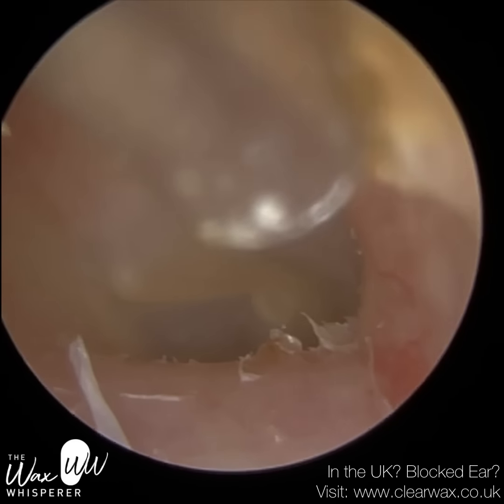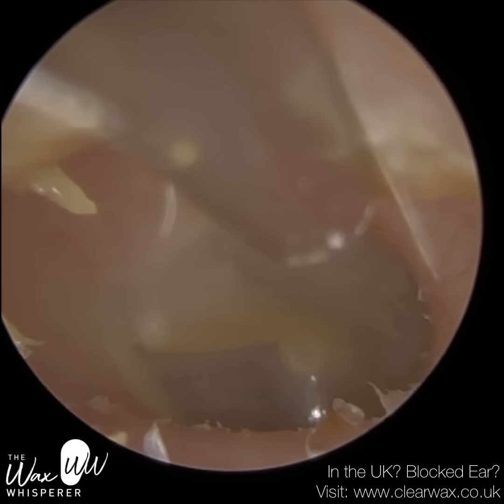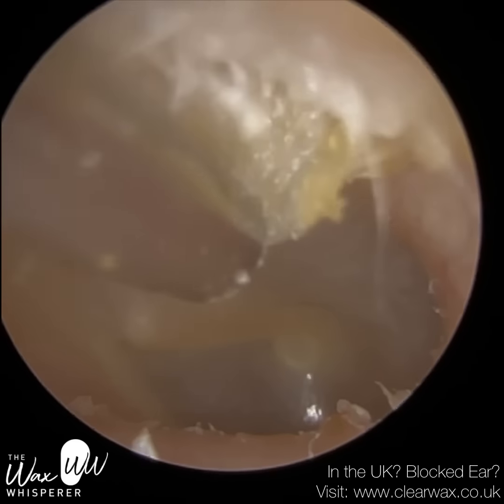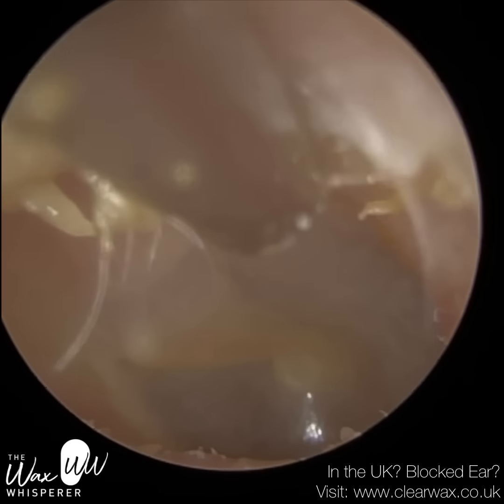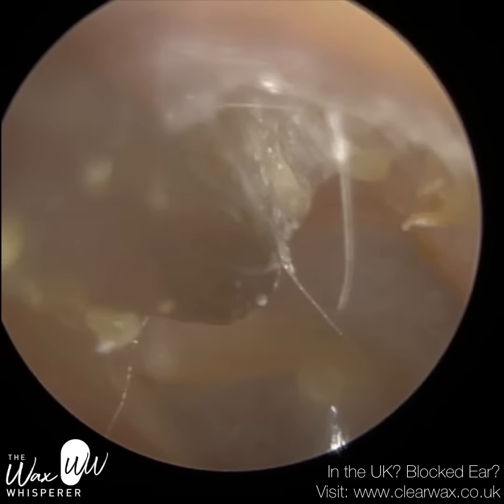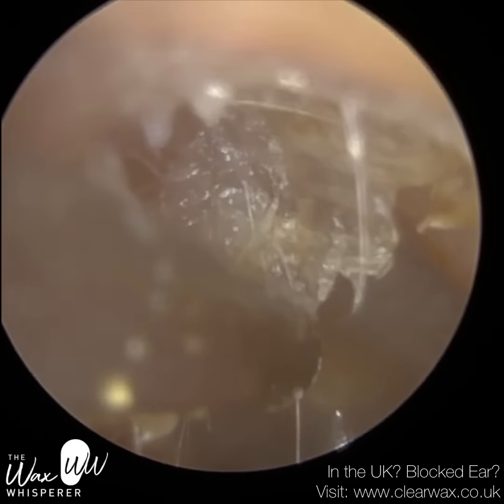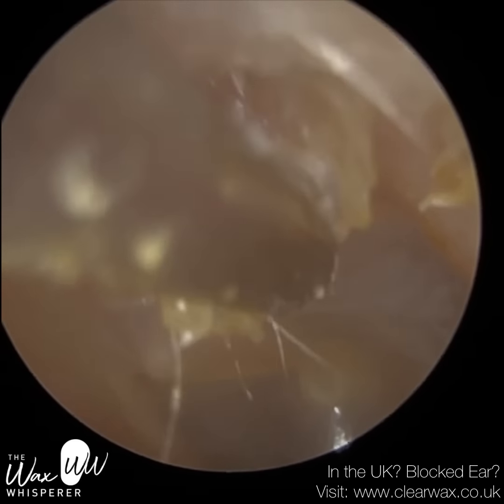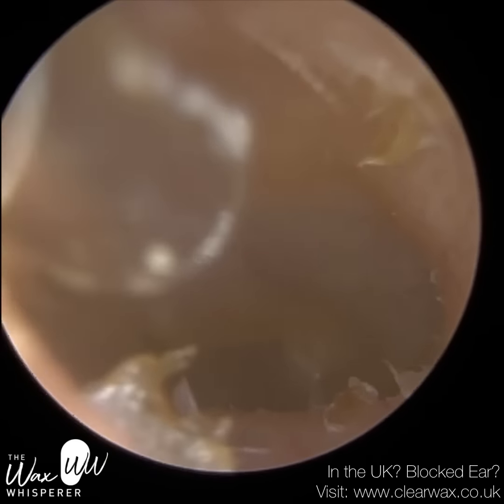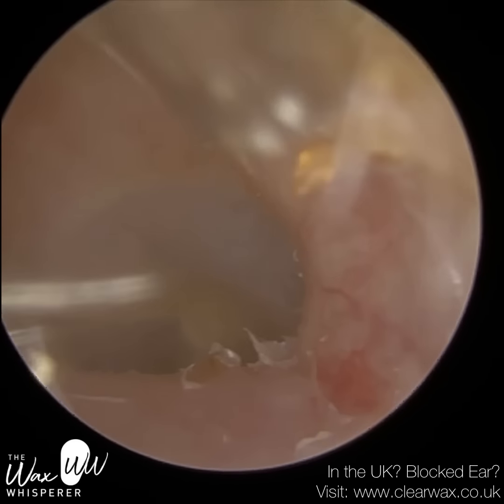The eardrum is nice and healthy. I'm just going to mop up some dead skin here as well. This is what we call the posterior canal wall — the back part — and there's also some skin superiorly on the roof, so I'm going to gently peel that away. This skin is almost like double-sided sticky tape — it's still adhered to the canal wall, and it can also envelope itself around the perimeter of a wax plug or dead skin plug. I'm just going around trying to get as much dead skin out as I possibly can.